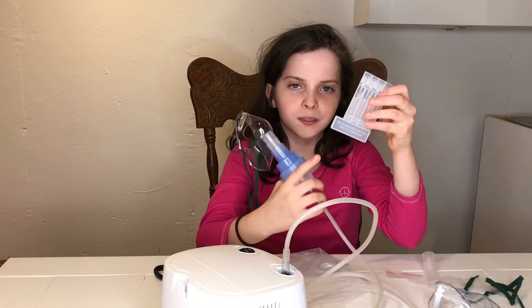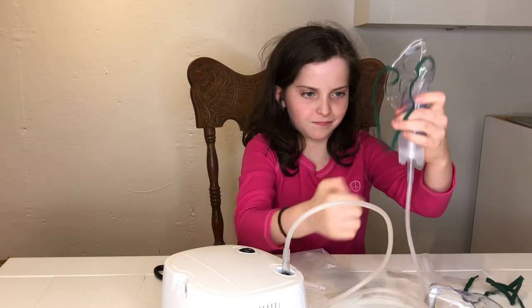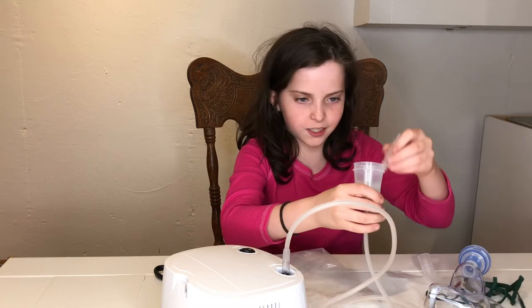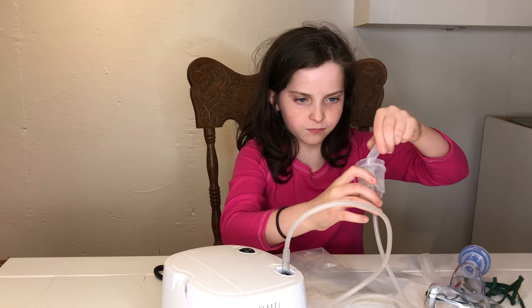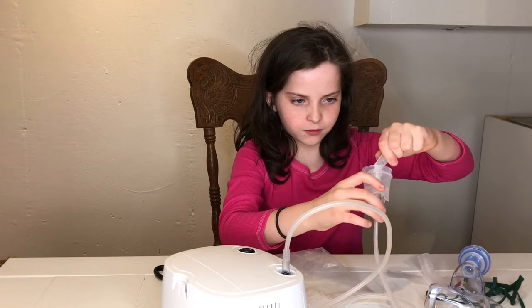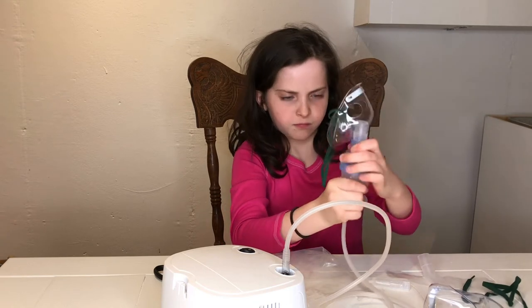So now I'm going to put this in. That's nice. Here we go.